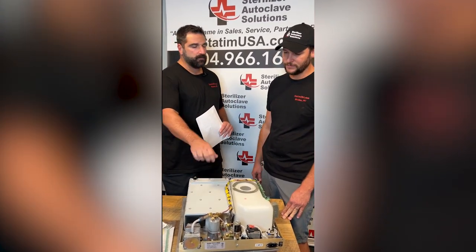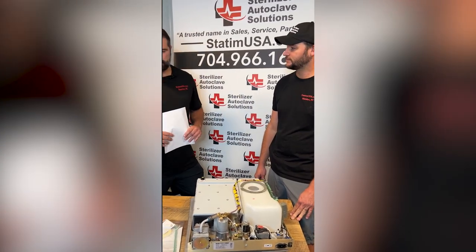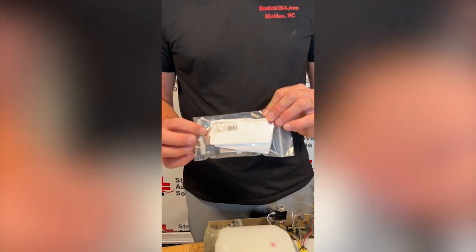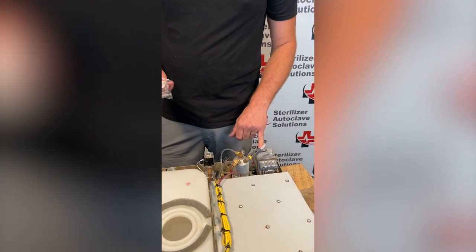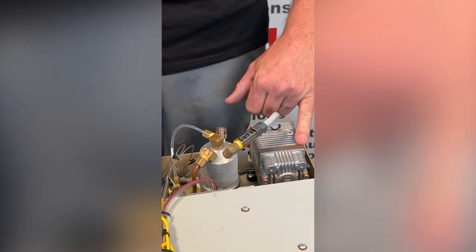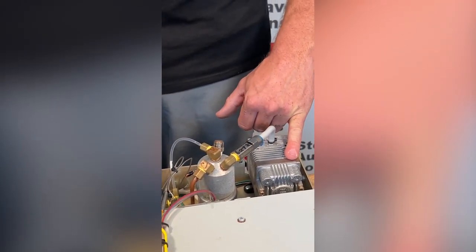Okay. And then every two years, the check valve. Excellent. Our two-year PM kit comes with a check valve. Your check valve is located on the back of your boiler, and it stops water from getting into your compressor. It is very important to change that on a minimum every two years, because if not, then you are looking at over a thousand dollars for a replacement compressor.